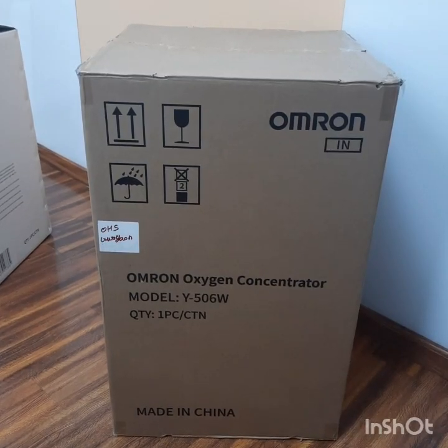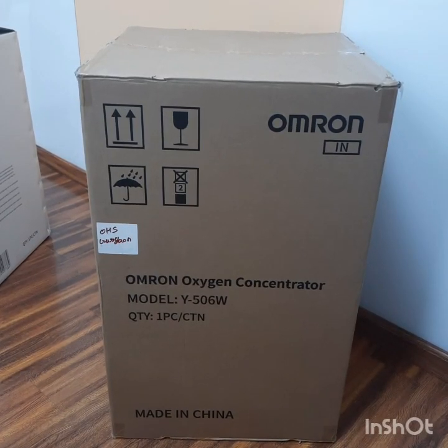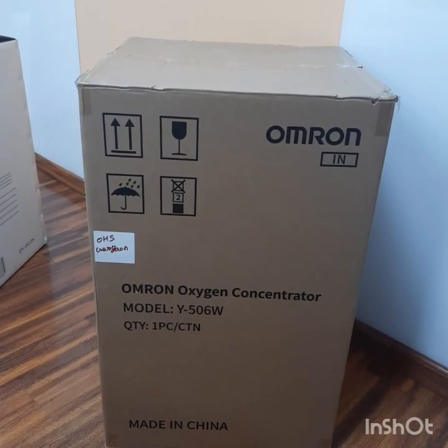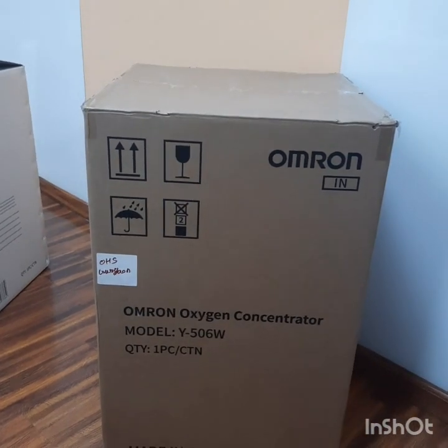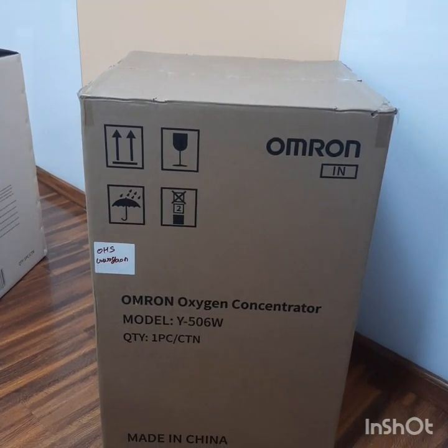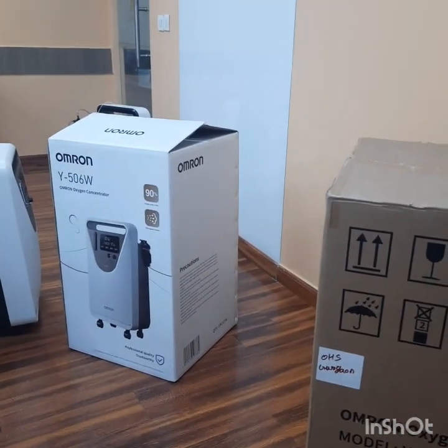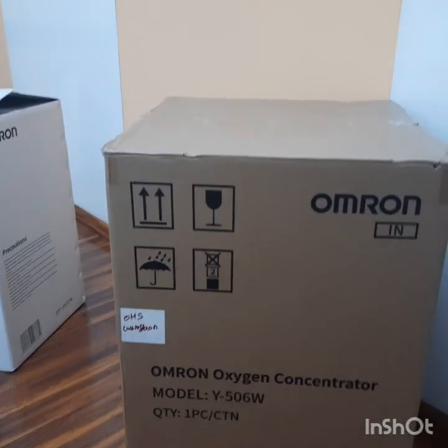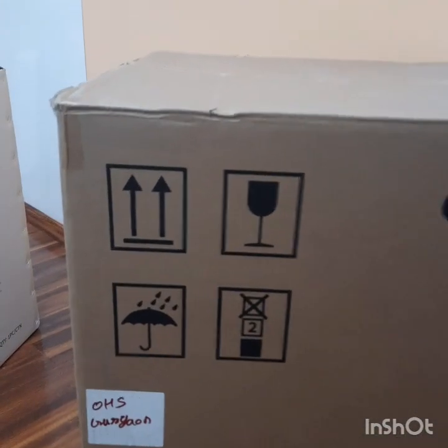Good morning friends. Today we will do the unboxing of Omron Oxygen Concentrator Model Y506W. This is the outer box and the machine comes in this inner white box. Let's see the instructions given on the outer box.